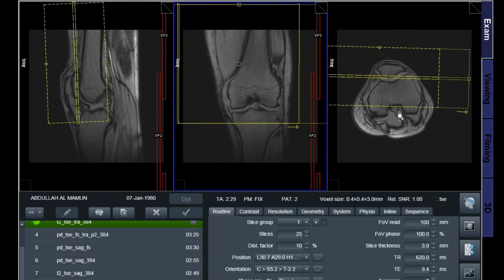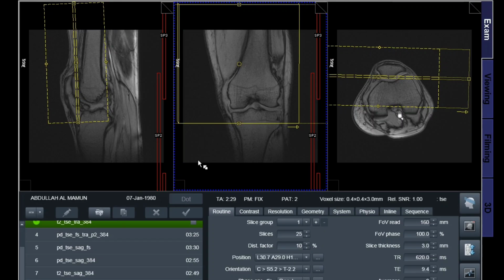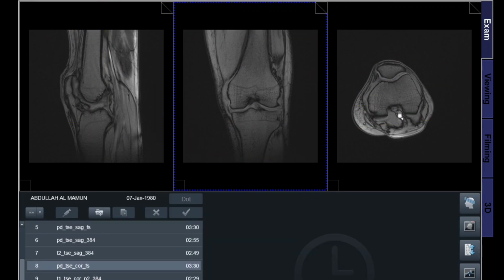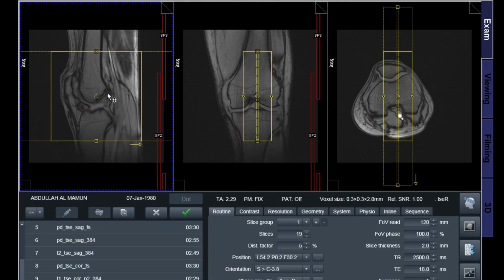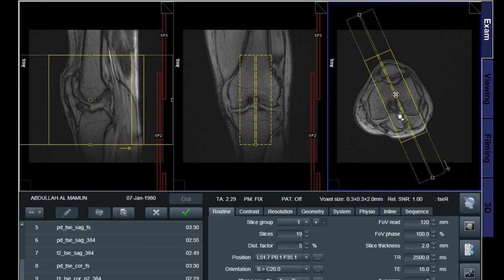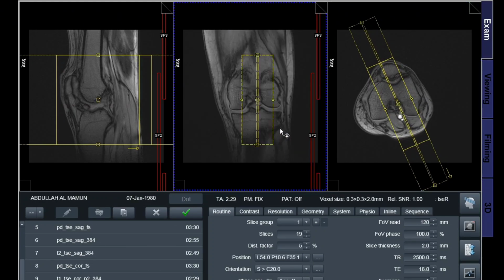How is MRI left knee performed? During the procedure, the patient lies on a movable table. The left knee is properly positioned. The machine makes loud knocking sounds. The patient must remain still. The scan usually takes 15 to 30 minutes. The procedure is safe and painless. If the patient has a pacemaker, metal implant, or any metallic object in the body, it must be informed to the doctor before MRI.